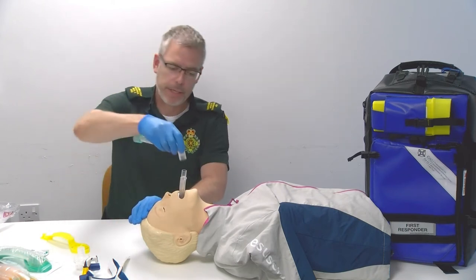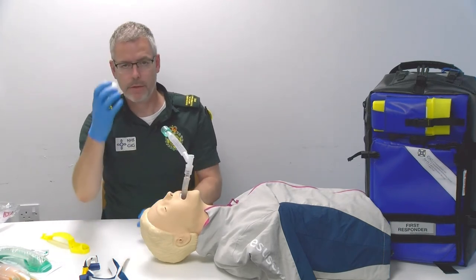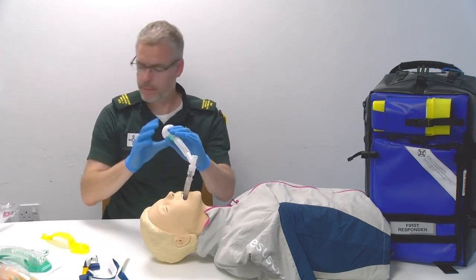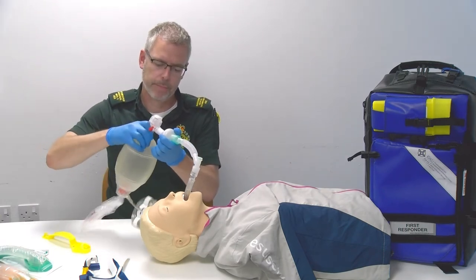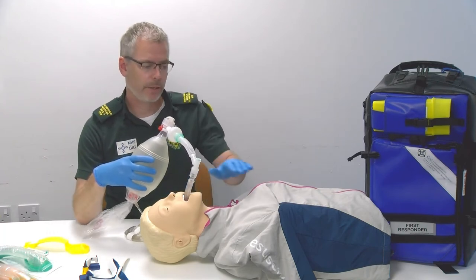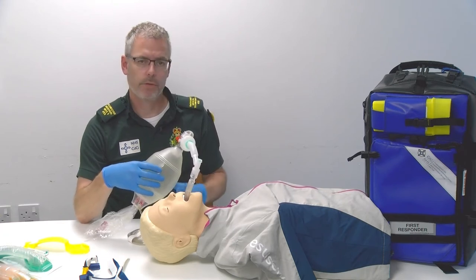Then you're going to attach your catheter mount, then your bacteria filter, then connect your BVM bag valve mask. Then gently squeeze the bag and check for rise and fall of the chest. There was a rise and fall there.